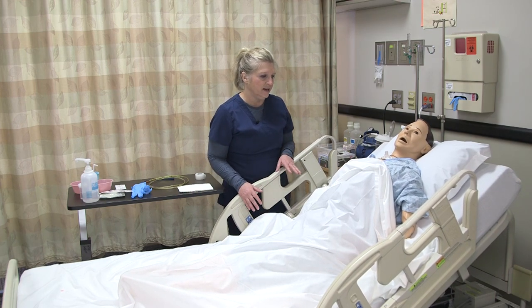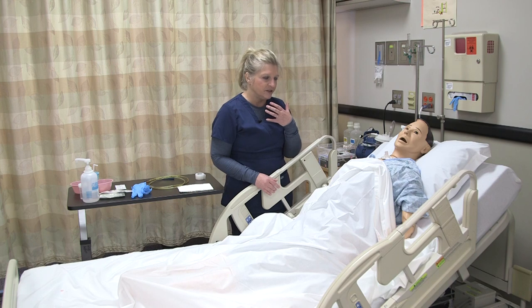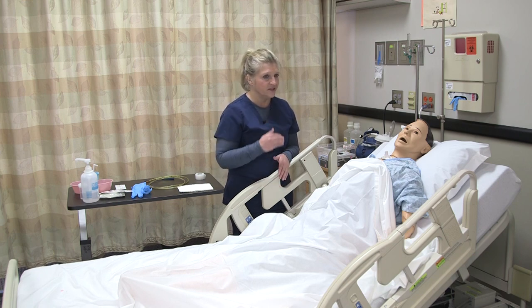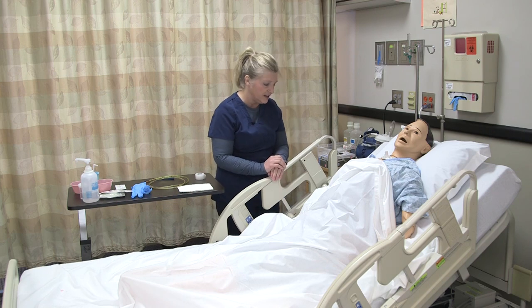I have the patient's head of bed elevated — just make sure they can tolerate that position before you do that. The other assessment I want to make sure I perform before doing this procedure is making sure the patient doesn't have any facial trauma. If they have facial trauma or any fractures in their cheeks or nose and you insert an NG tube, it's possible you could cause more complications and damage if that tube enters into the fracture — because behind your nares and soft palate is your brain, so you want to be aware of that.